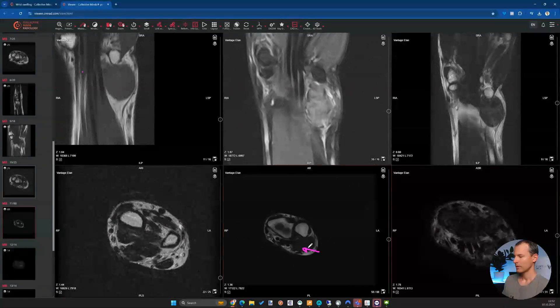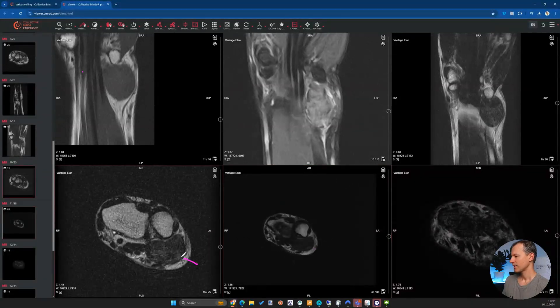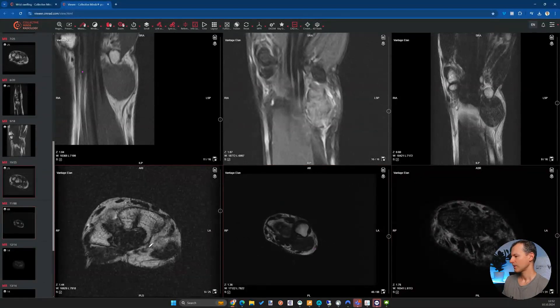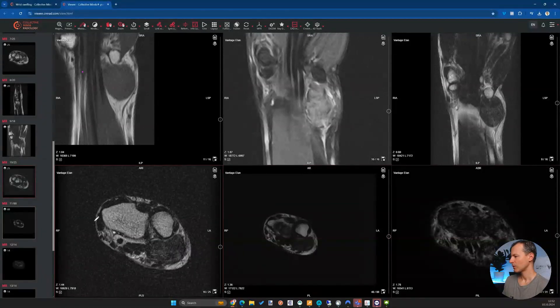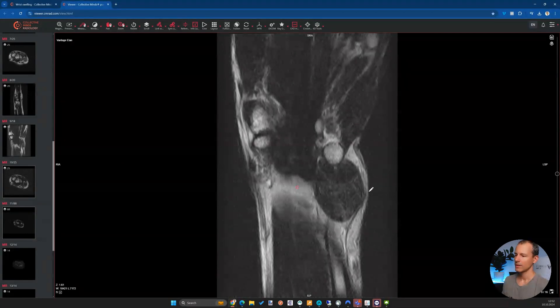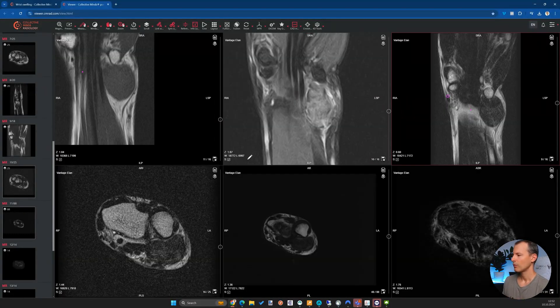On T2 this is a very low signal tumor — we've already established this across all T2 series. Fluid is bright and this mass is very dark. Whenever I see something like this, my differentials in terms of composition are always: PVNS, gout, amyloid, or some other fibrotic tumor, scar, or anything containing more fibrosis than would normally be expected.